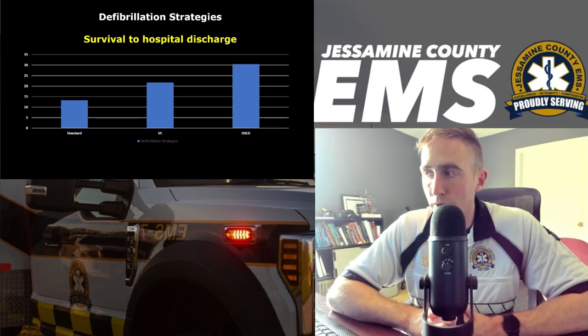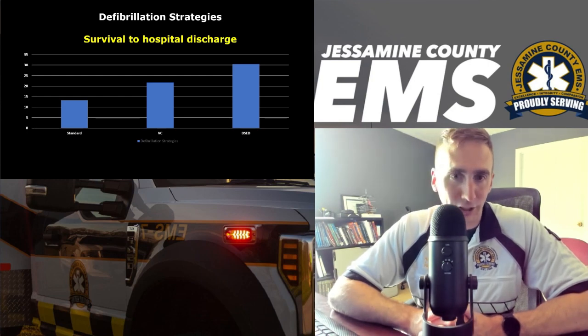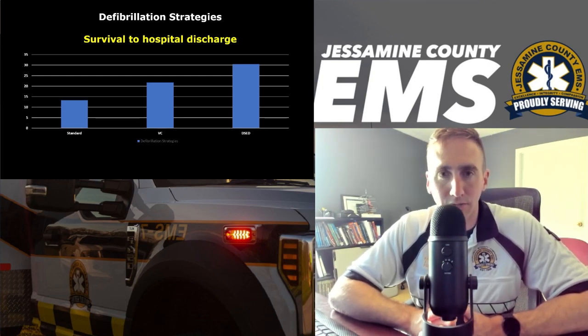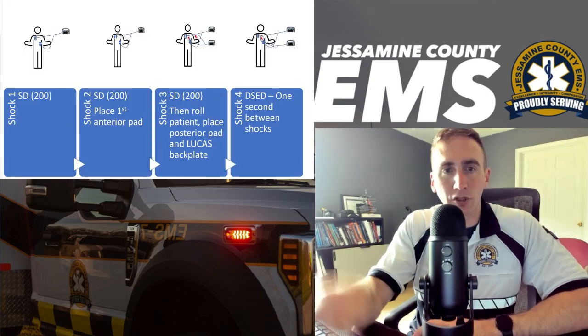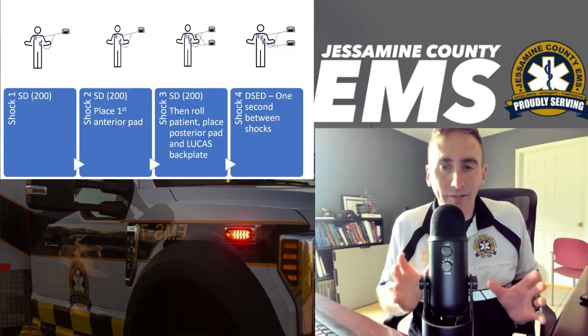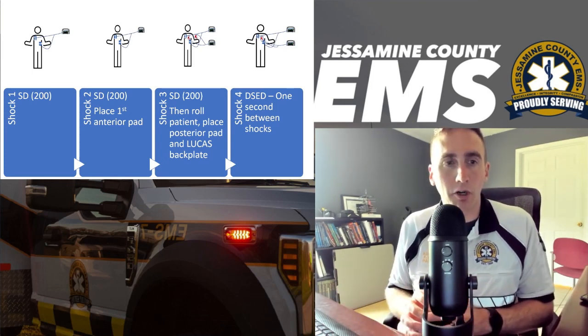And when I was talking to our medical director about this, we were trying to determine if we're going to keep the vector change in the protocol or if we're going to get rid of it altogether. And we decided that if dual sequential is that successful at increasing survival to discharge and more effective than vector change, let's negate vector change altogether, go straight to dual sequential. So this is kind of how I envision it working with our high performance CPR model.